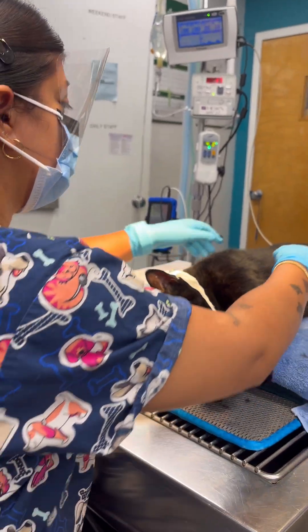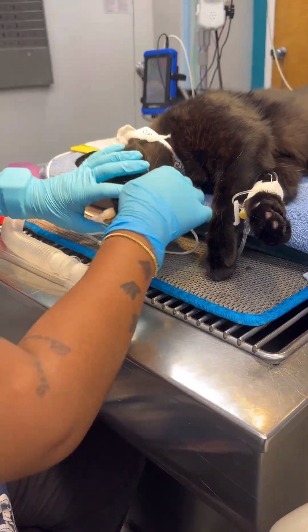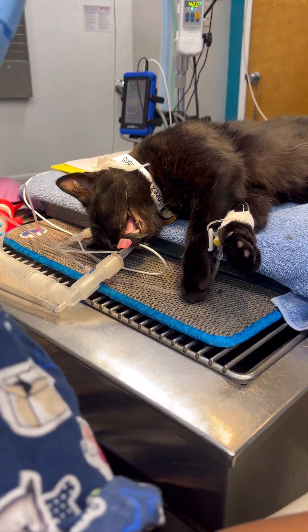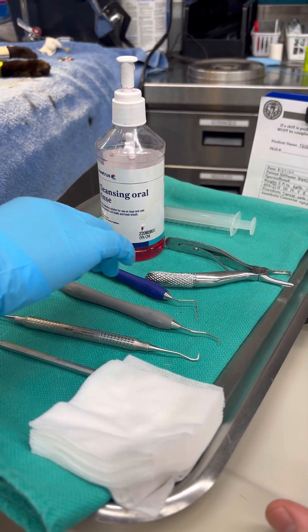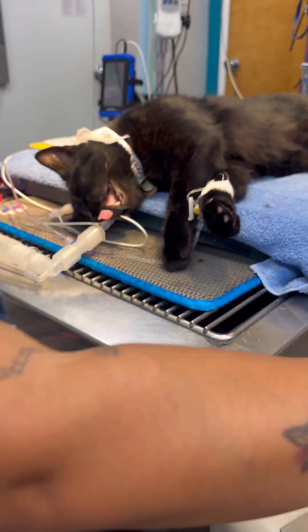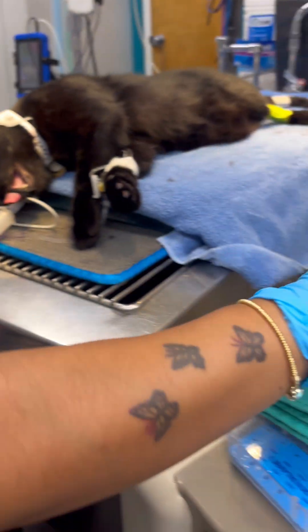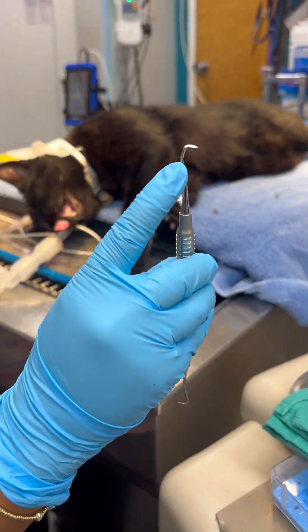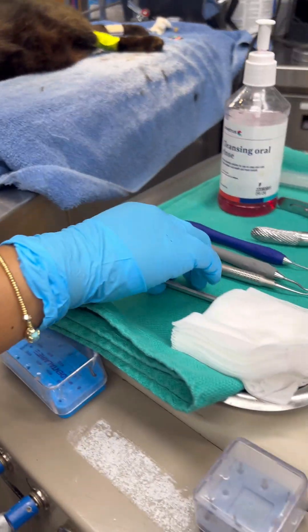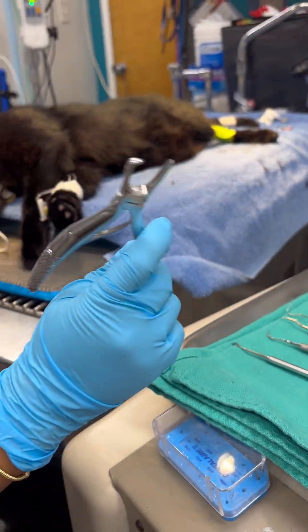And now I'm doing the manual dental, and I've gotten his this side. I have my periodontal probe and the shepherd's hook, I have the curette, I have my scaler, and then a small little tartar scraper, and then bigger tartar scrapers.